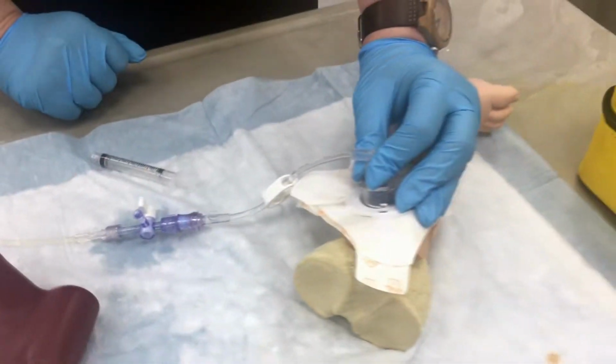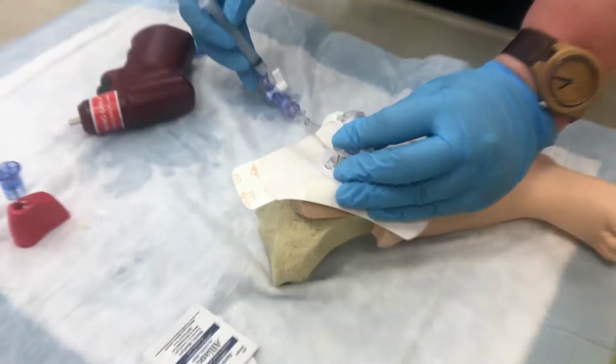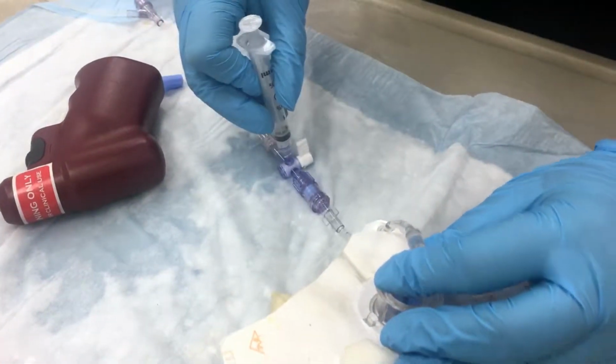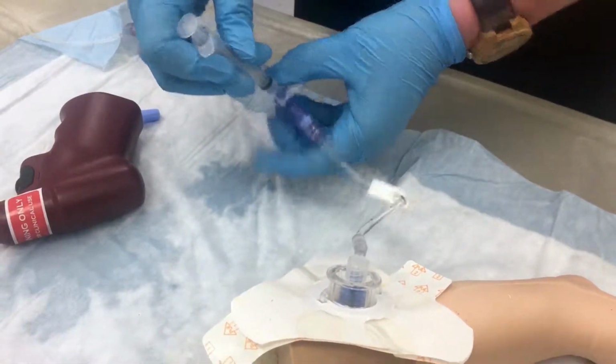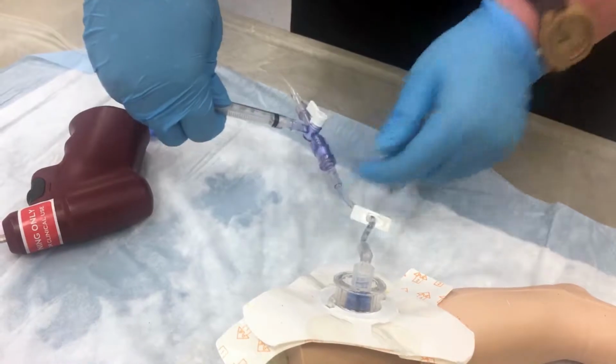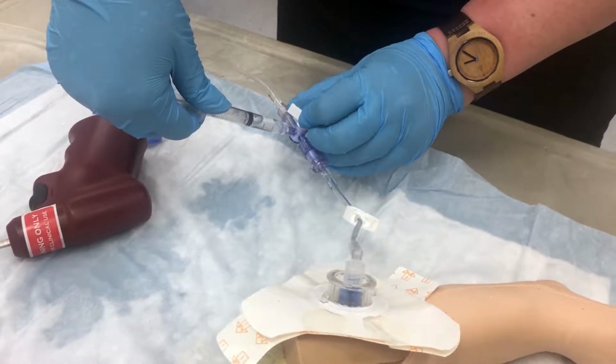Attach appropriate size syringe to stopcock with normal saline flush. Prior to flush, aspirate slightly for visual confirmation of bone marrow. Infuse 5 to 10 mL of saline, 2 to 5 mL for pediatrics, with the syringe and ensure easy passage of fluids. Check for infiltration.